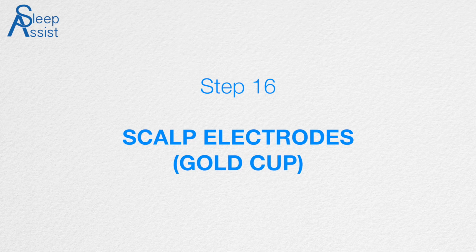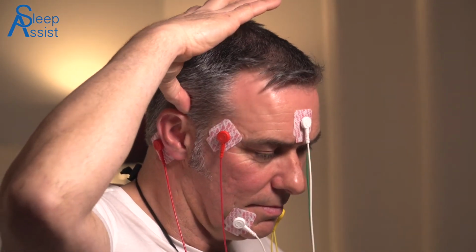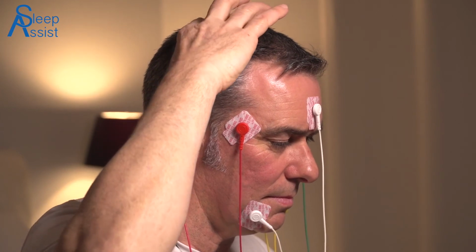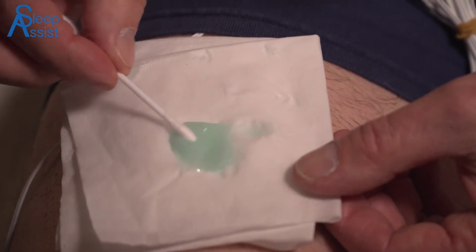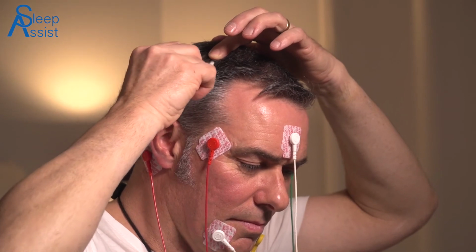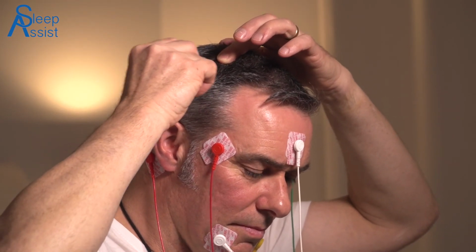Step 16. Scalp electrodes, gold cup. As shown here, using your thumb and forefinger, identify the top of your ear and the top of your head. Locate the halfway mark between the top of your head and the top of your ear. Using a cotton bud dipped in Nuprep, clean a patch of skin on your scalp the size of a 50-cent piece, rubbing with the cotton bud for 20 seconds. Do not use an alcohol swab.